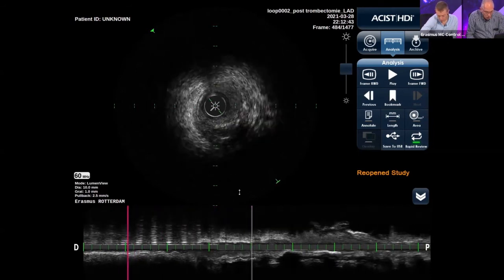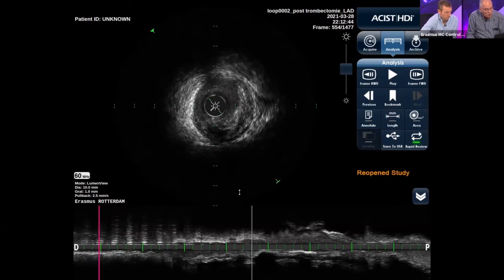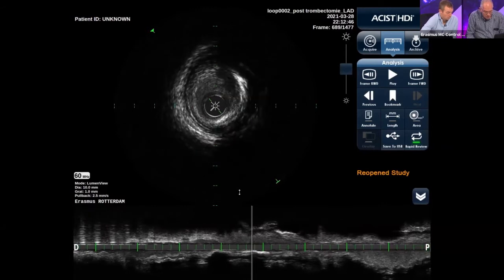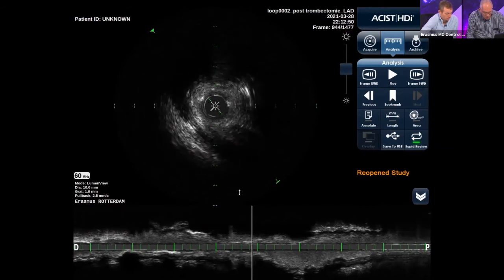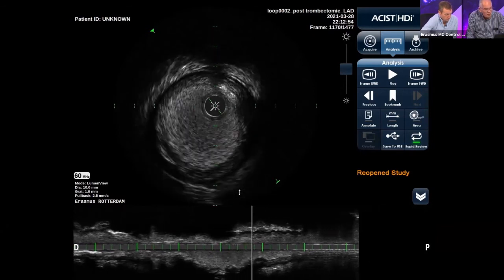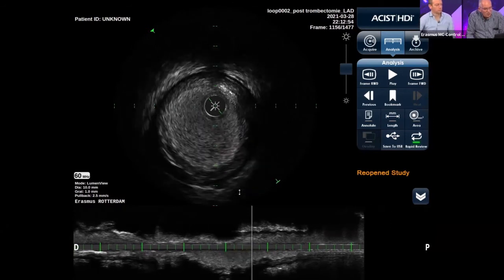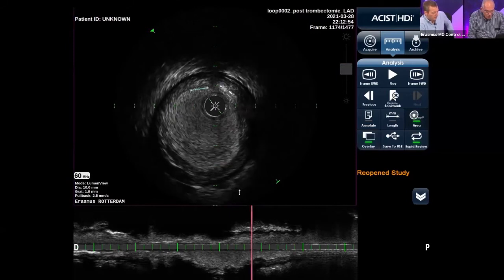And let's find our proximal landing zone where we want to have the stent. You appreciate that we want to cover this. We cover a side branch. We want to cover this part here, and in there. So we find the lumen that would be sufficient. And I would suggest going a little bit more proximal. I would go for this one. So you see already a lot of difference, a very long segment with a lot of tapering. Yeah, recognizing that distally there might be some spasm.